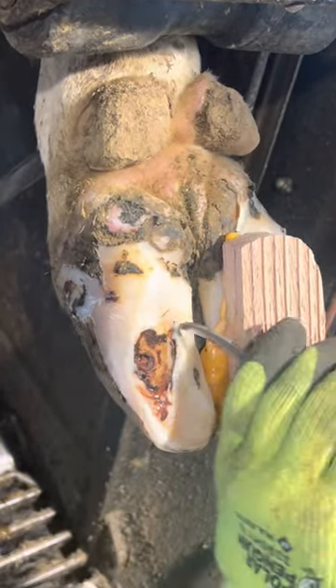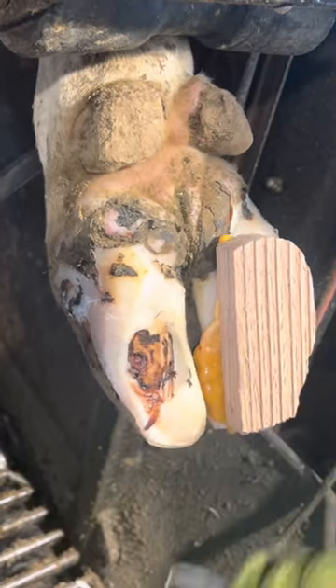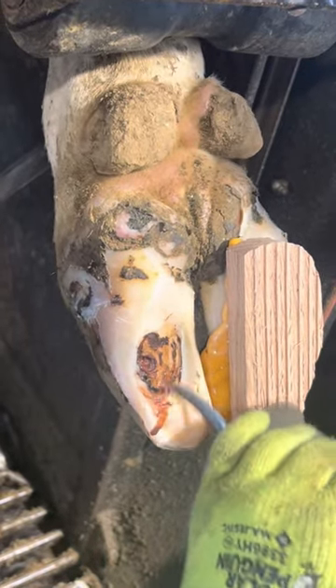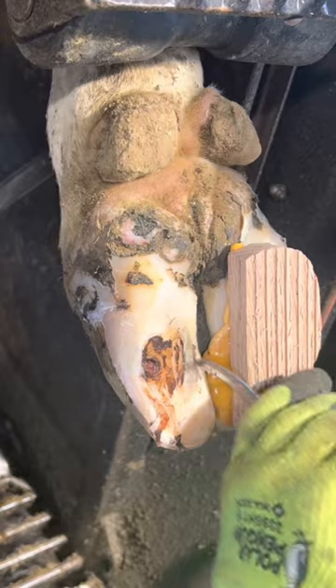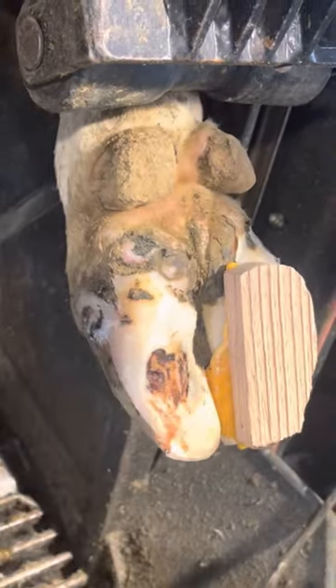Right now I'm picking away at all the loose horn — the loose horn is any horn that's not fully attached to the sole. You can see there's a gap that I just keep finding and picking away at. It's important to get all that out of there, otherwise it'll grow over the problem and potentially make it worse, and it'll definitely hold moisture, which is not good.